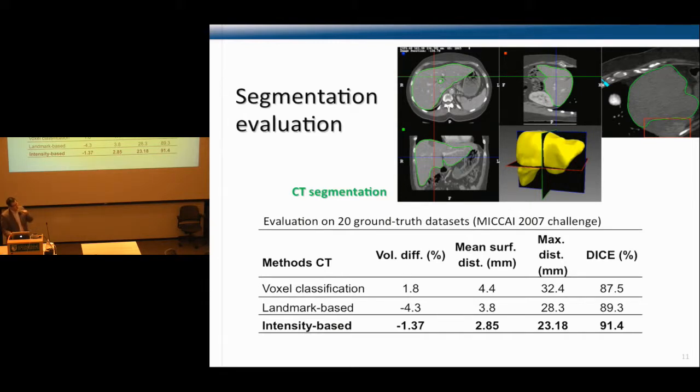One of the problems that we saw with that technique is this case that had a prior ablation. The segmentation didn't really include that. It's really up to the radiologist to determine if this needs to be included or not. But that zone showed an intensity distribution which was understandably quite different from the normal liver tissue in that region. So in that case, it didn't include the prior ablation zone in the liver. That's one problem that we're looking into, to take that into consideration during the segmentation process.